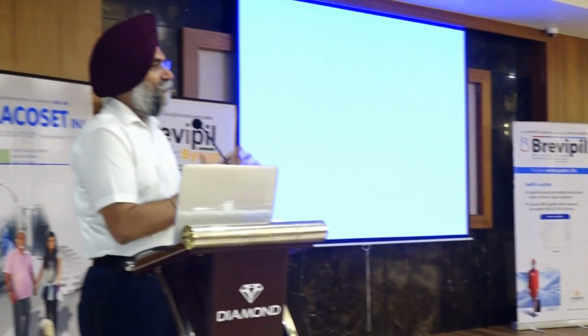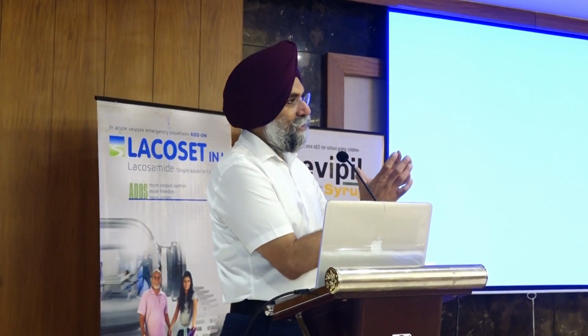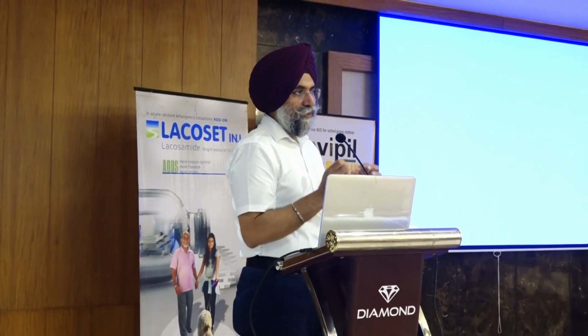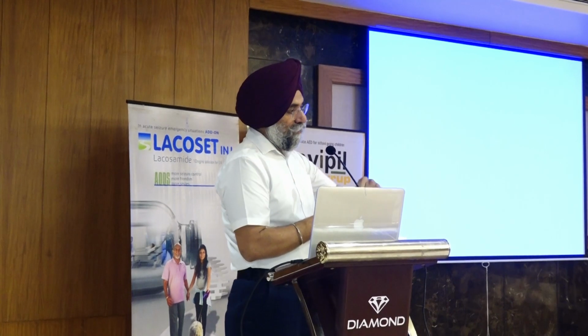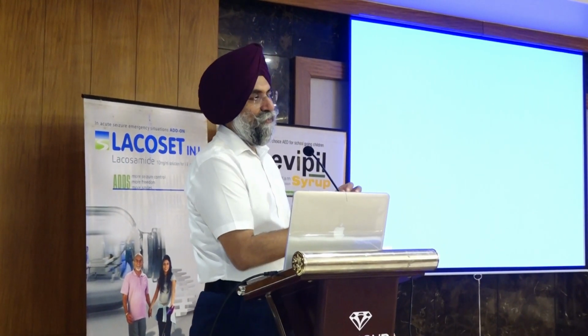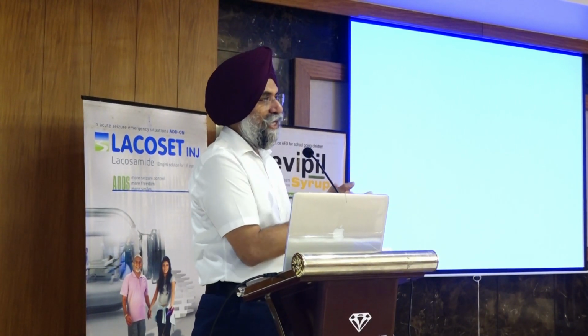Pardon? Perforator damage in surgery. Yes, how much of a problem is that? See, ultimately for that you need high magnification. Perforator damage happens when we have a very small corridor where the manipulation area is less and our magnification and illumination are less. That is when we start damaging the perforators, because we try to retract with the help of suction, bipolar, a retractor, or the operating assistant. So somehow we have to do it.